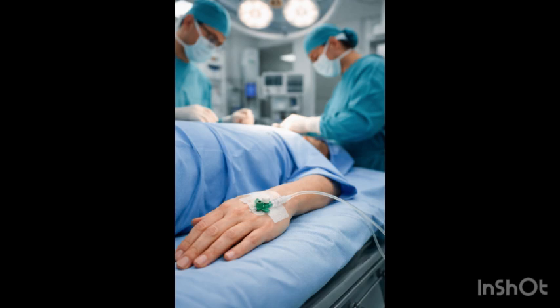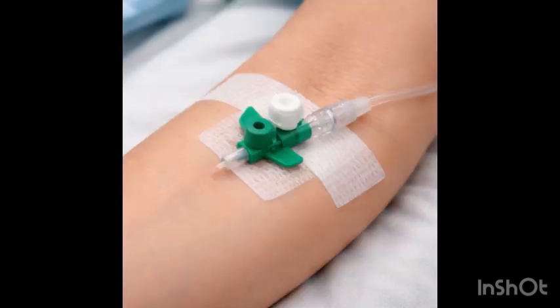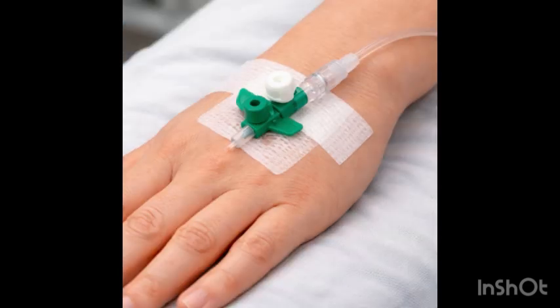So what are the sites you can use? You can use the cubital fossa. The veins are much bigger in the cubital fossa, and it is perfect for resuscitation, but it's not good for keeping a cannula in long term at that area, because the IV cannula at the cubital fossa may kink with elbow flexion. The next site is the dorsum of the hand, where you have much smaller veins, good for longer access.